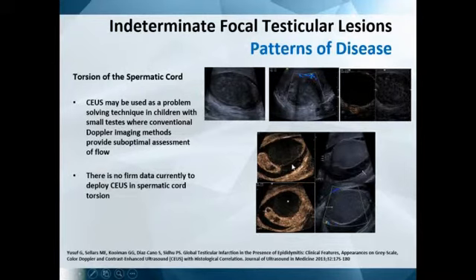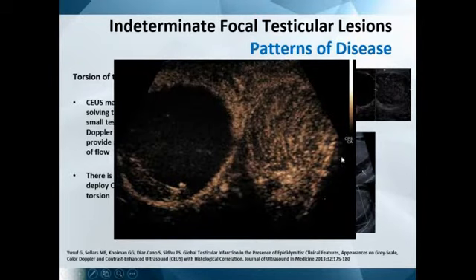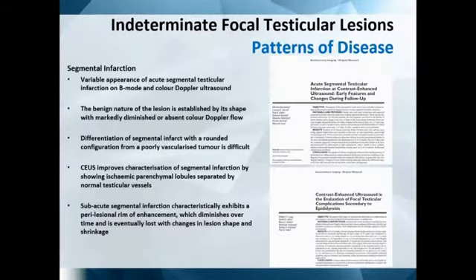But look, when you add contrast-enhanced ultrasound, it's absolutely clear that there's no vascularity to the testis itself, but there is vascularity to the epididymis, and there are a couple of epididymal abscesses. And if you do the spectacle view, you will see the vascularity in the normal testis and the complete absence of vascularity in the abnormal testis, making your diagnosis very clear, not equivocal, and you can be confident with this.